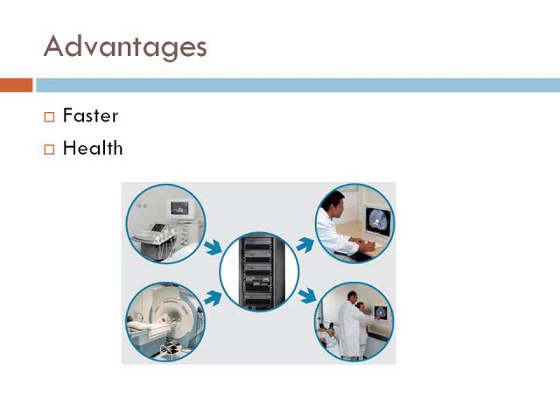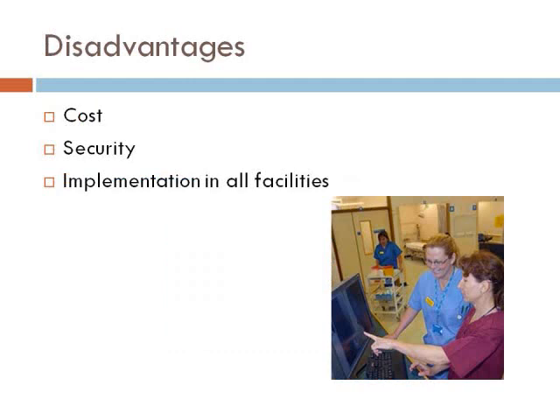They take less, so it is good for the patient's health, and also, if the hard copy image is ever lost, they have access to the system. It's always going to be there and stored digitally, so they have access to the images. There's no worry about it being lost. Next, we'll look at the disadvantages.